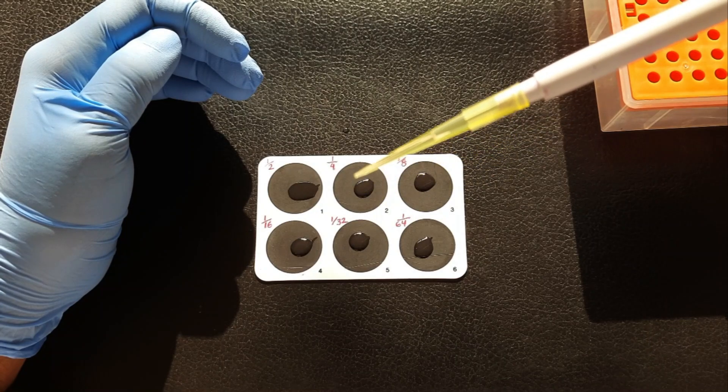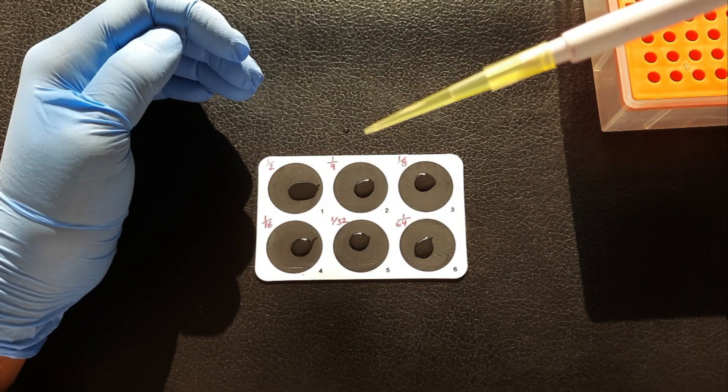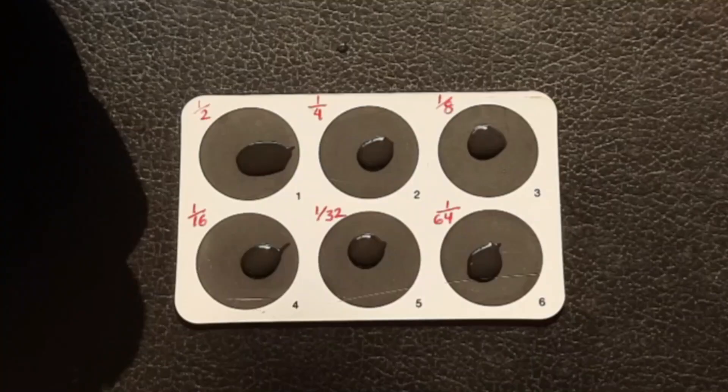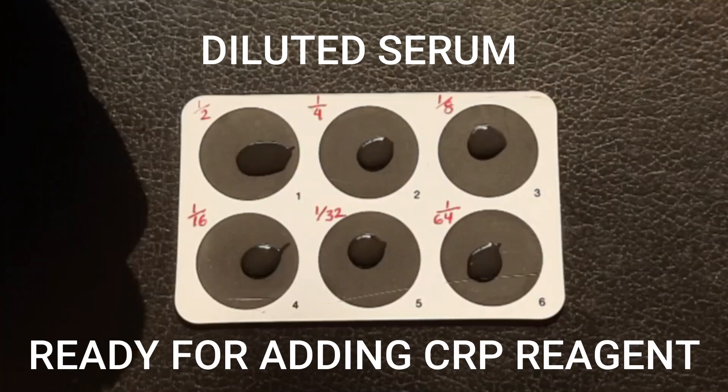Now, discard the last 50 microliter from the circle 6, done. We got our serum sample diluted serially, and it's ready now for adding CRP latex reagent.